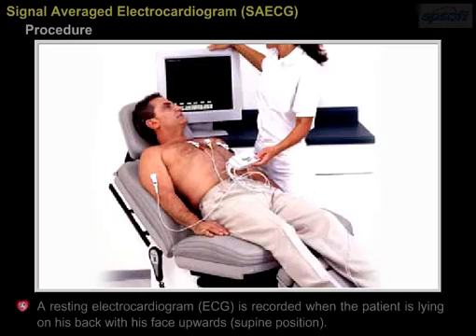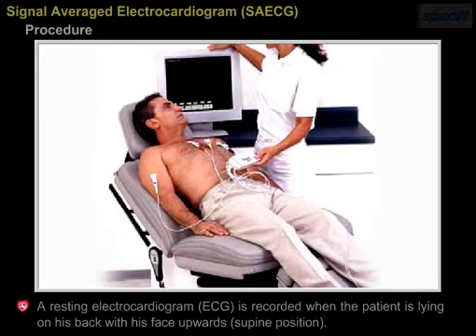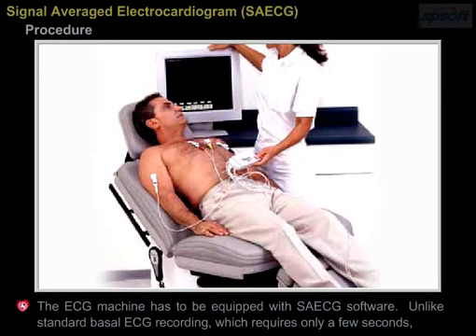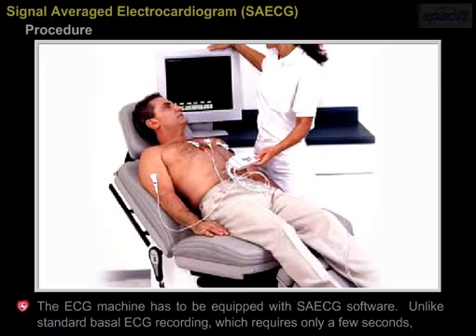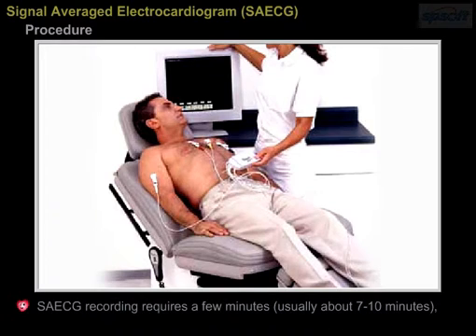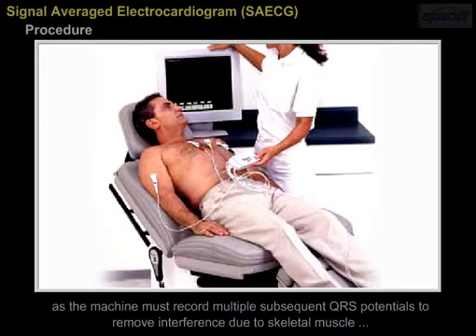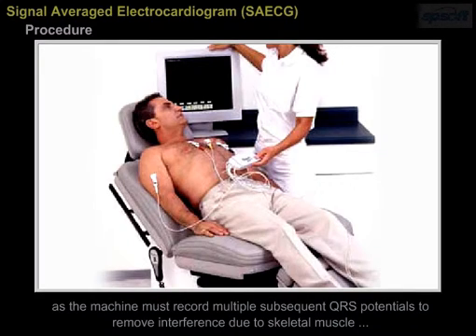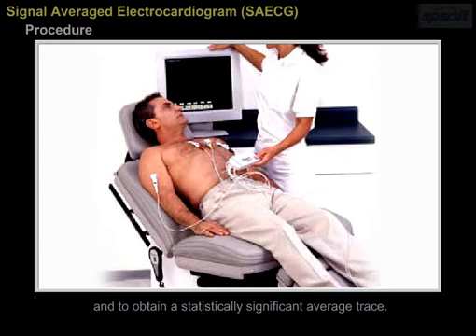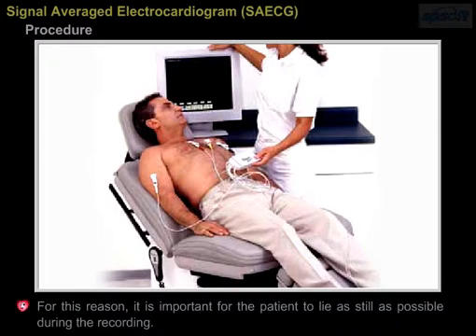Procedure: Resting electrocardiogram ECG is recorded when the patient is lying on his back with his face upward, supine position. The ECG machine has to be equipped with SAECG software. Unlike standard ECG recording which requires only a few seconds, SAECG recording requires a few minutes, usually about 7 to 10 minutes, as the machine must record multiple subsequent QRS potentials to remove interference due to skeletal muscle and to obtain a statistically sufficient average trace. For this reason, it is important for the patient to lie as still as possible during the recording.